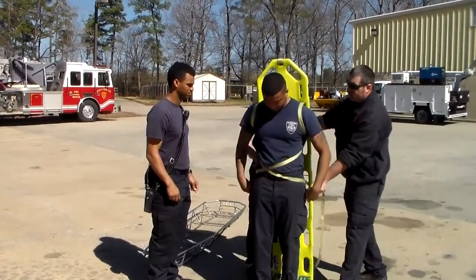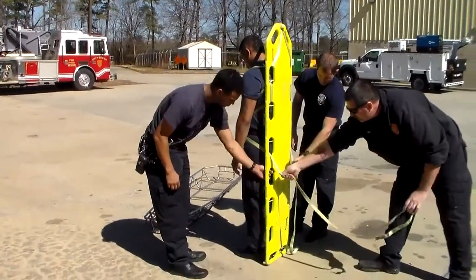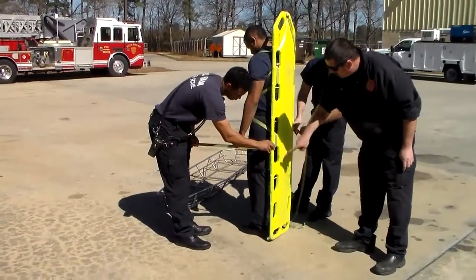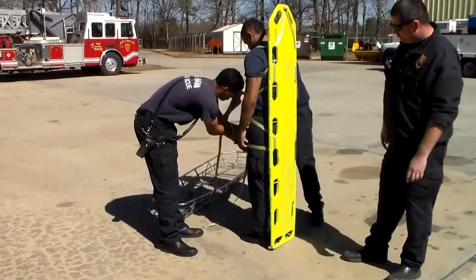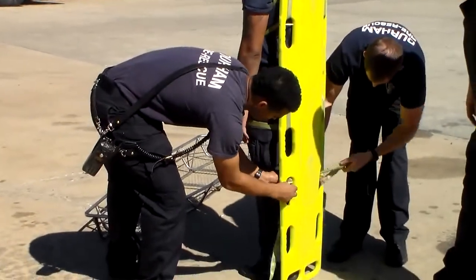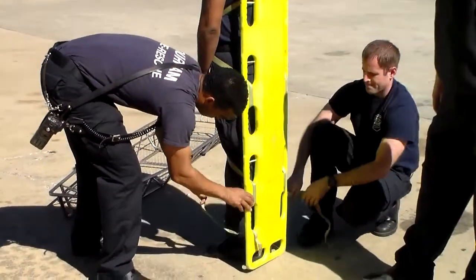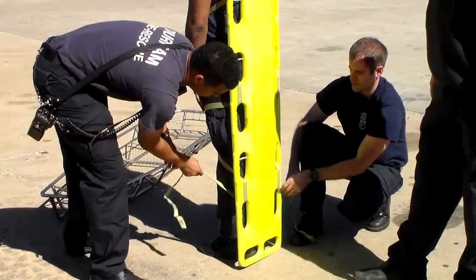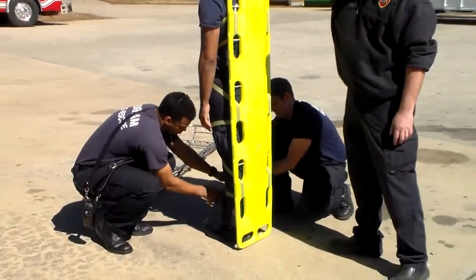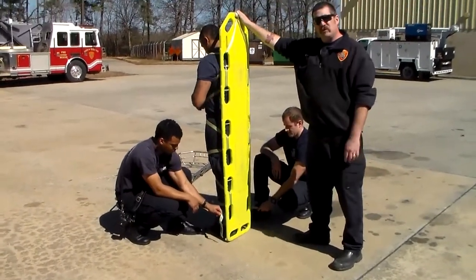We'll then drop down to our next port — out this hole, in the very next one, cross back over, in the very next hole, out the very next hole, and then cross back over. Depending on what the patient looks like, how large or how small the patient is will dictate how much webbing we'll need.